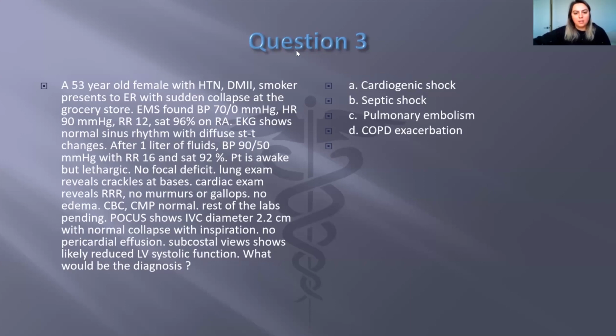Next one is, sometimes in patients with chronic right heart failure or severe HFpEF, they have a permanently dilated and non-collapsible IVC, despite being hypovolemic. I'm sorry, I have to learn some of these words. Volemic or hypovolemic, yes. And it keeps on assessing fluid status in this condition. So chronic right heart failure, severe HFpEF, usually have a dilated IVC despite hypovolemia.